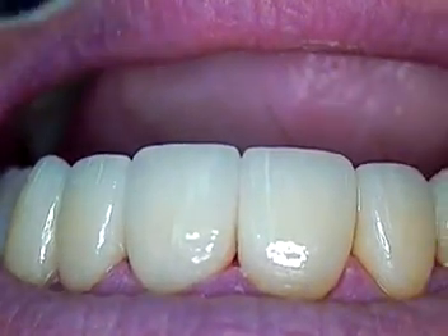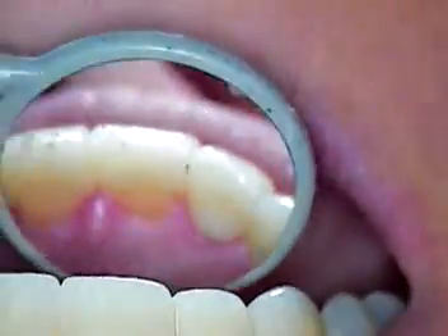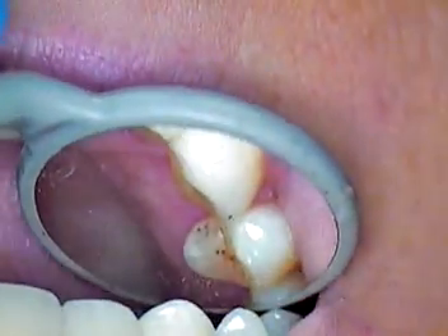This case was a B1. We got exactly that — a nice B1 shade, beautiful color, nice contours.